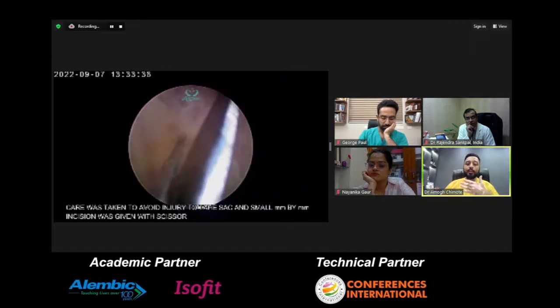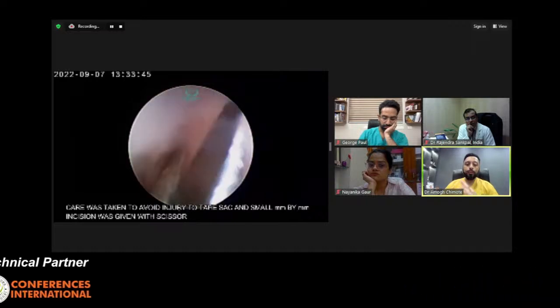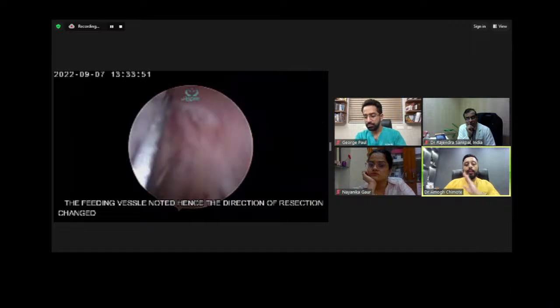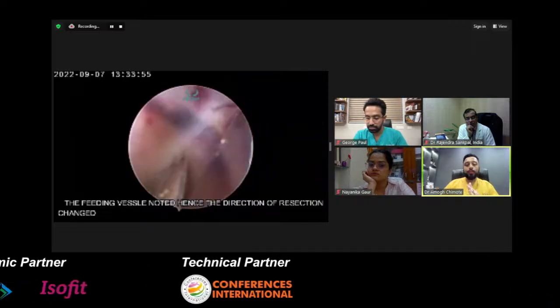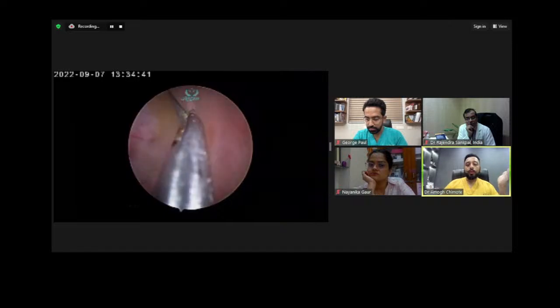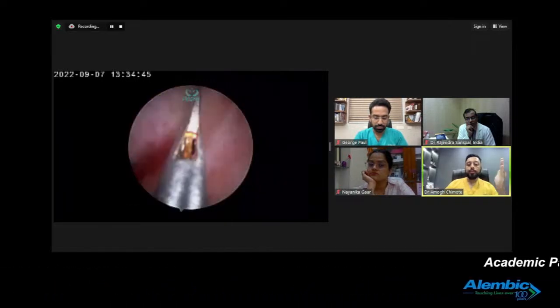As you can see, there were small feeding vessels, and I knew that the moment I cut it, it would cause a lot of bleeding. So I just left that part and went around it, went circumferentially around the sac, and finished the complete excision of the sac.